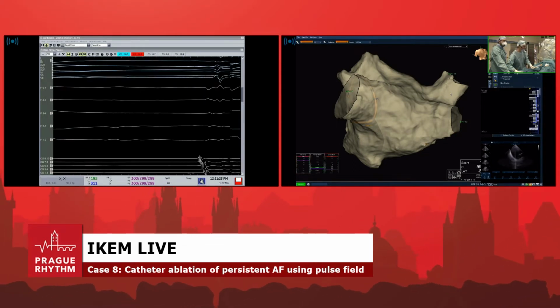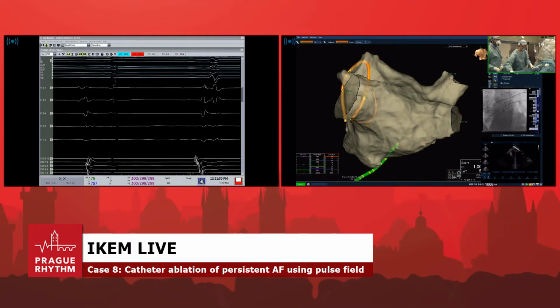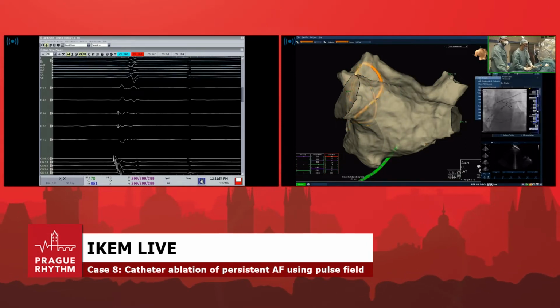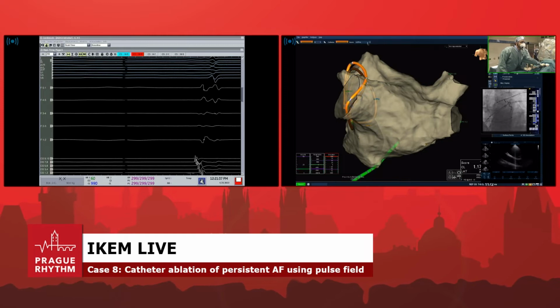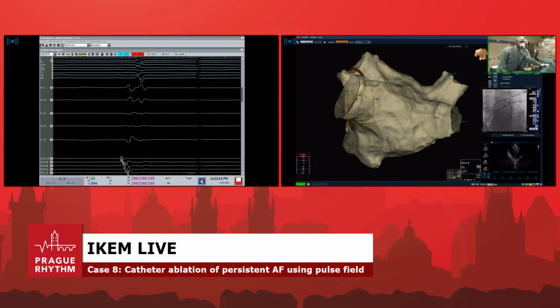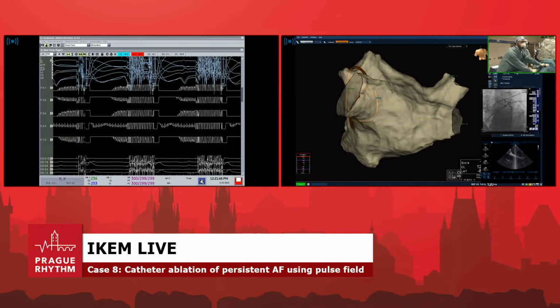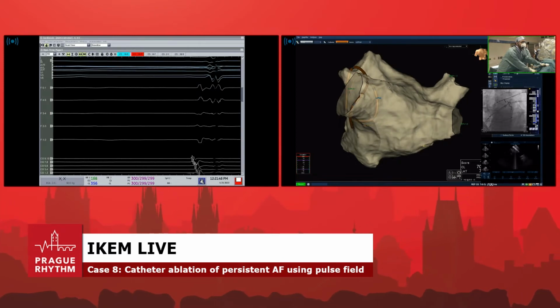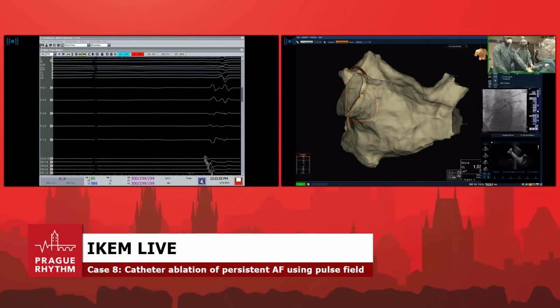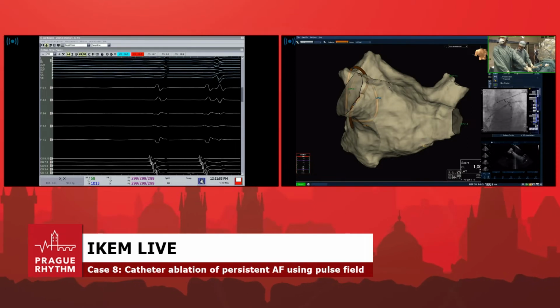Okay, now let's go in a flower. Sorry about the wire. Keep it there. Okay, we go with a flower. Good. So, Predrag, do you like it on ice? Yeah, let's go. LSPV, pulse 5. LSPV, pulse 6 when ready. Yep, deliver.